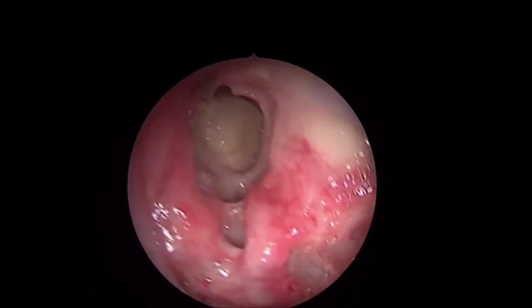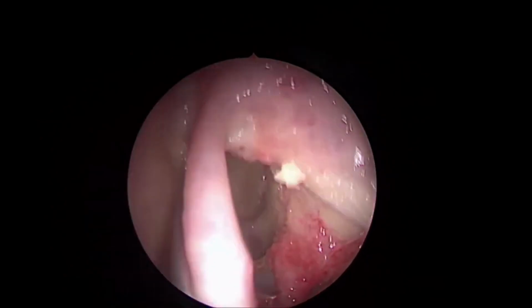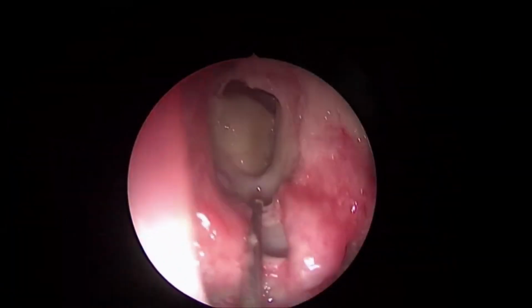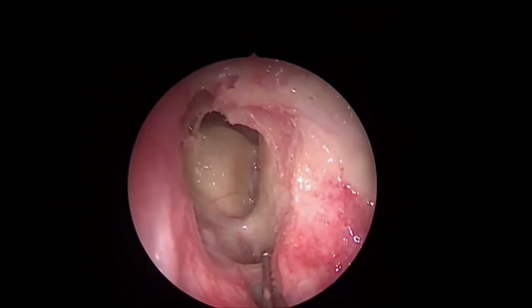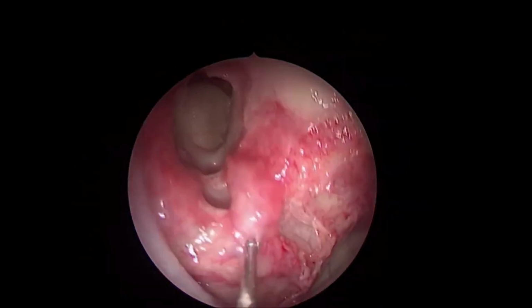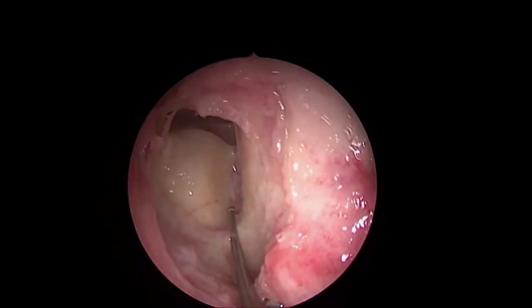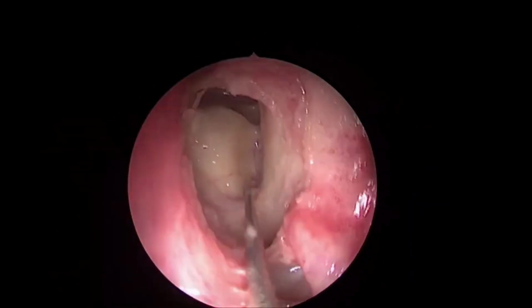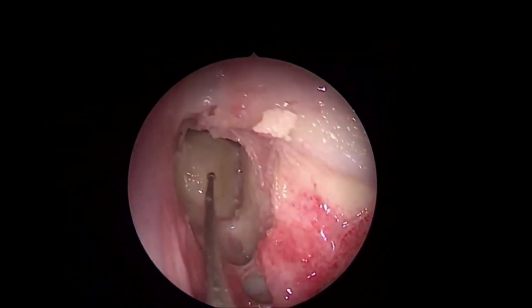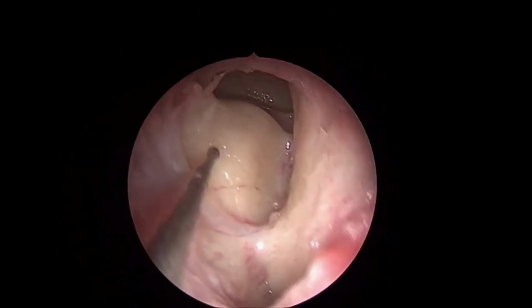Sir, can you show us the supraorbital cell? Can you tell us more about it? Yes, that's what I was coming to. In this patient, fortunately, he has the most favorable anatomy. There is not much cellularity behind to obstruct the frontal drainage pathway, and one of them is the supraorbital cell. Even this bulla, see this bulla? This bulla is not extending to the skull base. This can be dangerous sometimes. Why I'm saying this? This bulla normally, in over 95% of situations, goes up to the skull base, and in that situation it covers the anterior ethmoidal artery on its own.